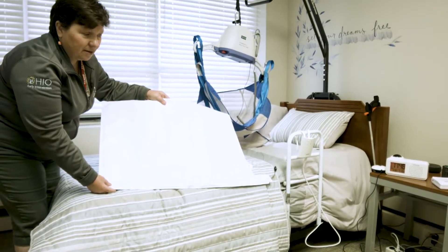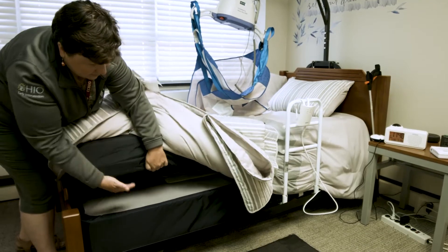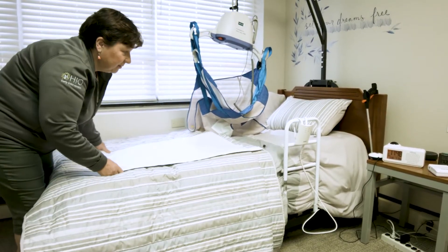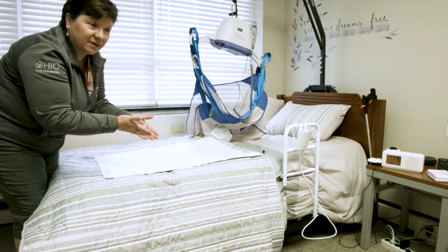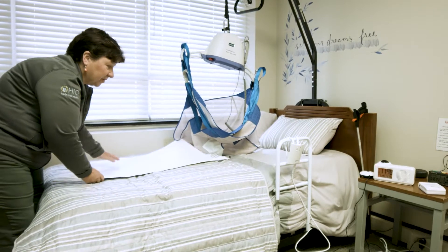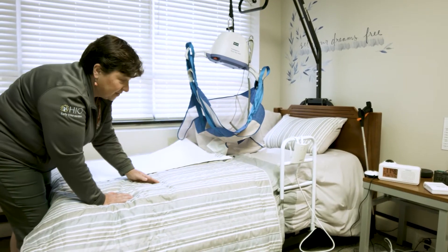A seizure mat can be placed underneath the mattress, and once it's under the mattress, this mat will detect if the person is having a seizure while they're in bed. I'm going to imitate the rhythmic movement of a seizure, and then this alarm will go off after a set amount of time.